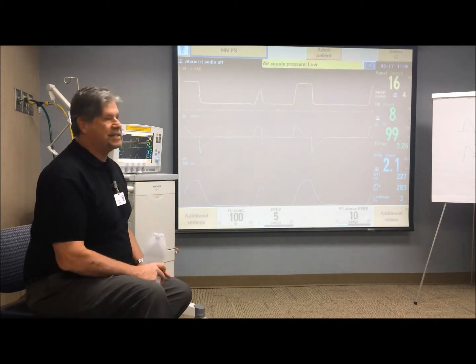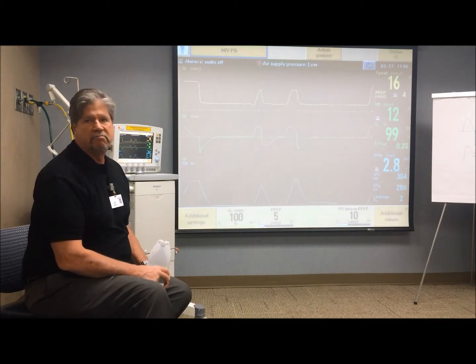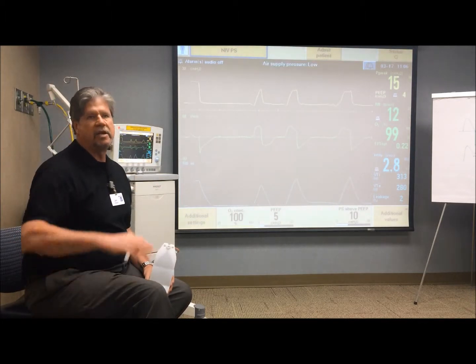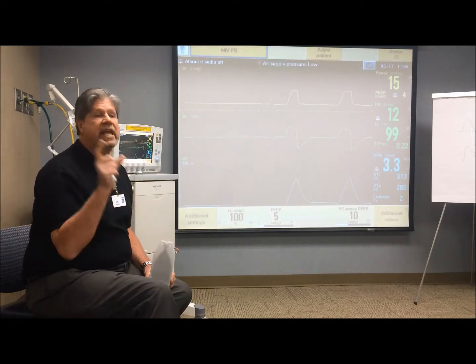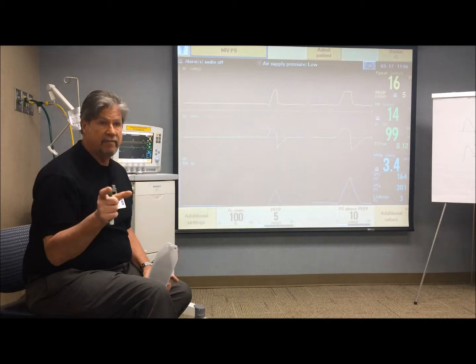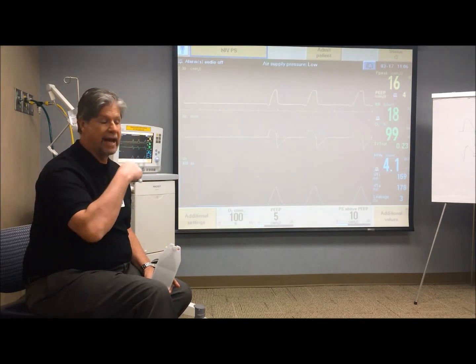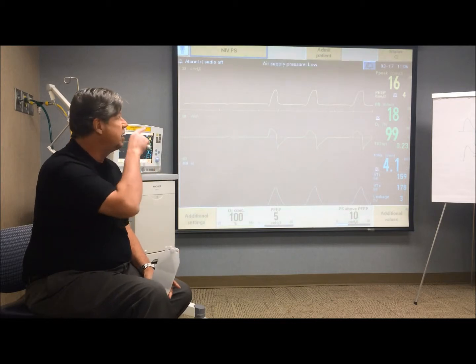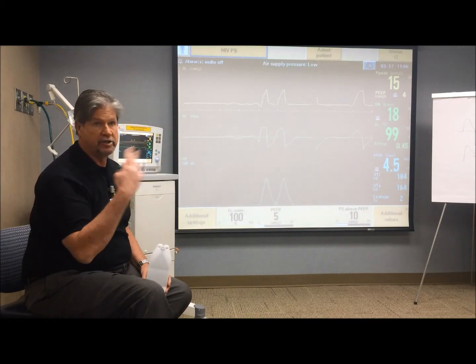But if he has an apnea now, and then another one in 10 minutes, another one in another 10 minutes, he could do that all day in invasive. It's just that if it's within 2 minutes in invasive, then you're going to get locked out. He'll remain in backup, and you have to manipulate the ventilator. Here, he can have 3 apneas within 2 minutes, and it doesn't matter. He'll just keep going back and forth.